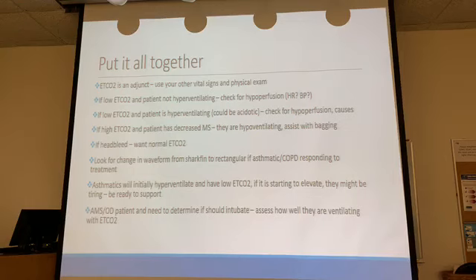What if your end-tidal CO2 is high? Okay, that means they could be hypoventilating, right? They're not breathing fast enough. Perfusion doesn't necessarily cause it to go up high, but if you're sitting there with an end-tidal CO2 of 70, the patient may not be breathing very much. So look and see if they're hypoventilating. If they are, bag them, assist their breathing, okay? Or if you just gave them bicarb, expect it to be high, right?